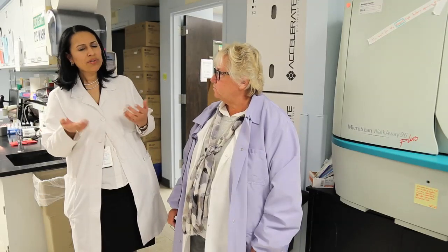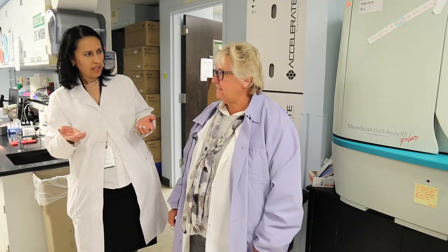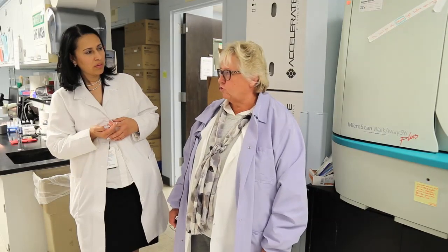Okay, and you said it's about 24 hours, correct? 18 hours of incubation. Right. For certain organisms, it needs a full 24 hours. For the Enterococcus, for the vancomycin, and for the Staph aureus, for the vancomycin. But the gram-negative rods are due in 18 hours. It doesn't give me anything before 18 hours. Okay, and you wouldn't need to hold it much longer than that? No, that's standard protocol. Leaving it longer is not going to give you any further information. Okay.